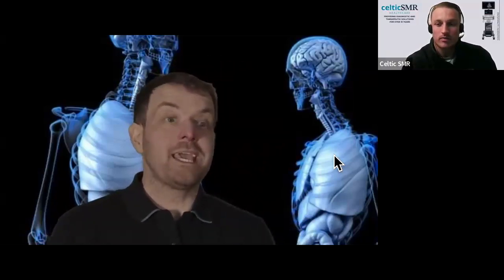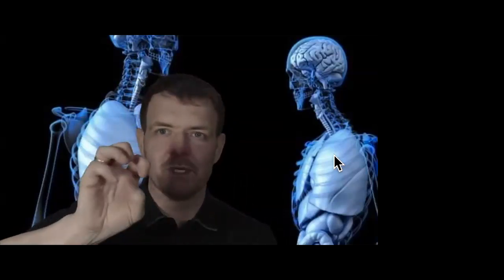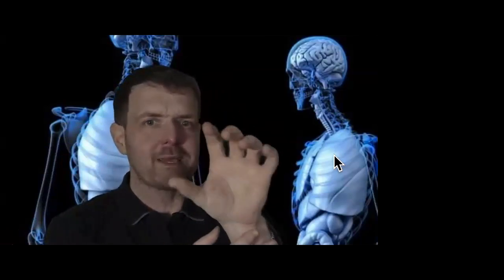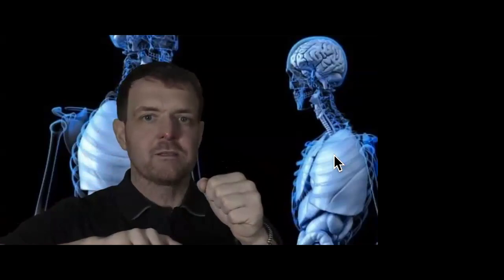So, do you use hypervascular on Doppler to detect injury? Yeah, you can do. What the Doppler will pick up is fluid movement. So if you've got an area that is inflamed and you use the Doppler on a high setting, then it will go really, really speckledy and it will flicker. But you've got to be careful that you don't move the probe, because if you move the probe and you've got it on that setting, it will pick up the movement of the probe rather than the fluid movement underneath. But yes, I would.